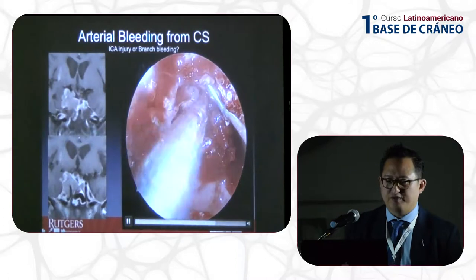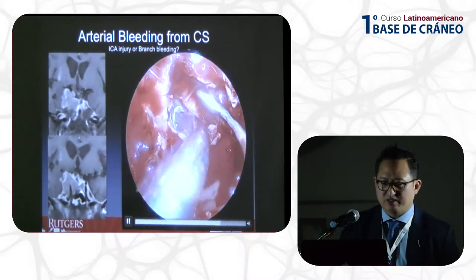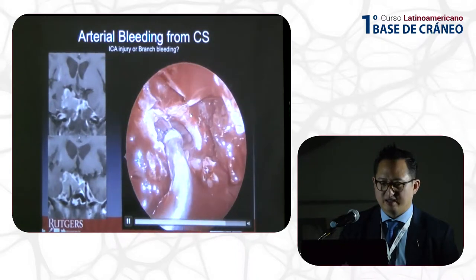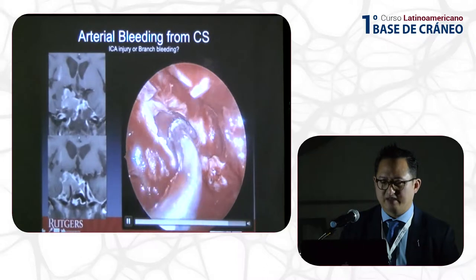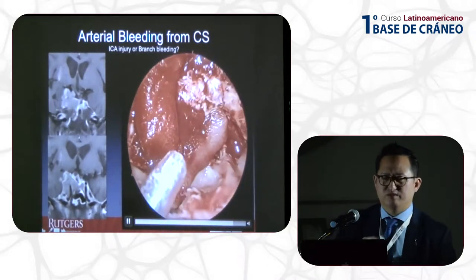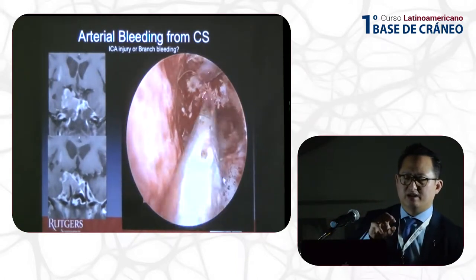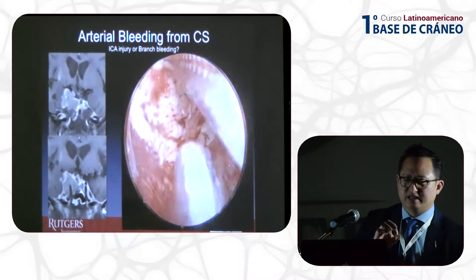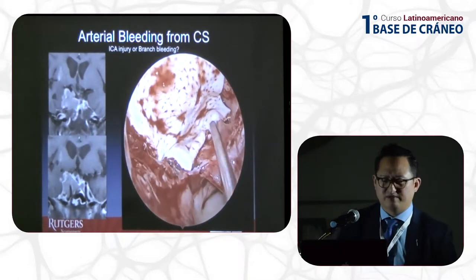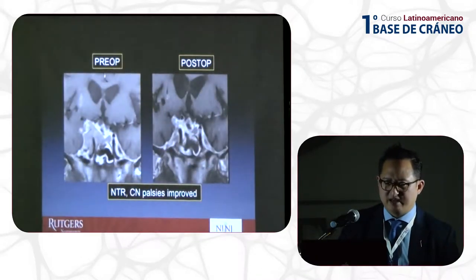And so now we'll have full access of the cavernous ICA. And we'll use a curved suction. This is a curved suction going laterally. So here's the course coming anteriorly. The area that's most difficult to remove is the tumor as it exits the cavernous sinus posteriorly through the oculomotor trigone. And I think endonasally, that area of tumor is hard to remove, so I generally am not too aggressive with that. And here's the post-op scan.